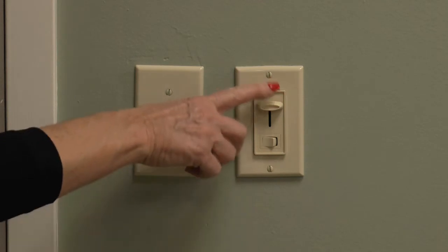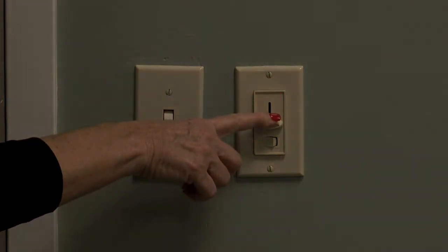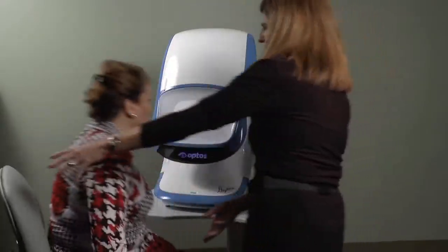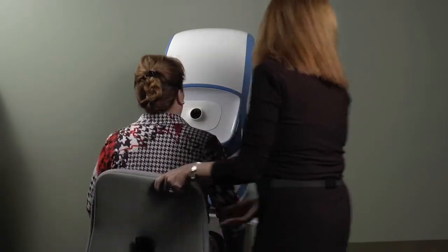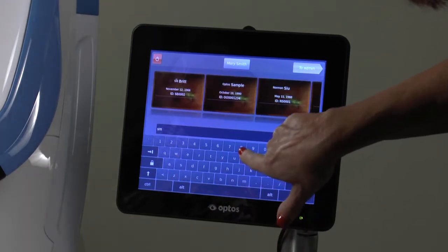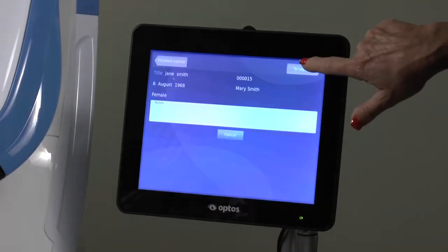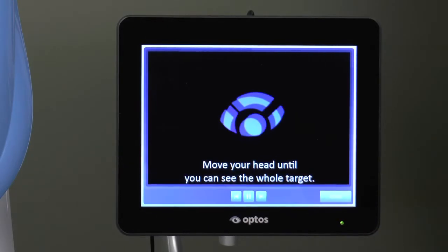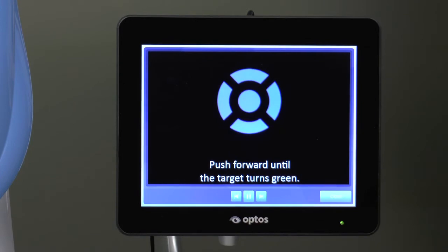Dim the lighting in the room to achieve maximum natural dilation of the pupils before attempting to capture an image. Have the patient sit in the chair and move in close to the device. Pull up the existing patient record by typing in the first few letters of their last name, then select the appropriate patient and press the capture button at top right. Tapping on the question mark at the bottom right-hand corner of the screen launches an animated video that demonstrates what the patient will see when they look into the device and how to determine when they are correctly aligned. When the video is finished, tap the close button.